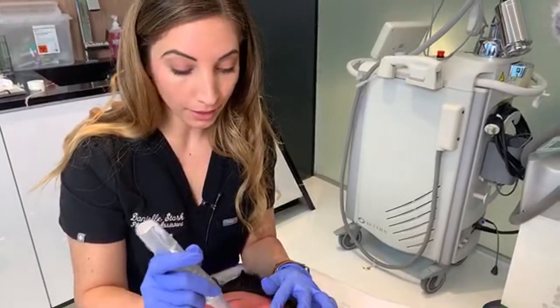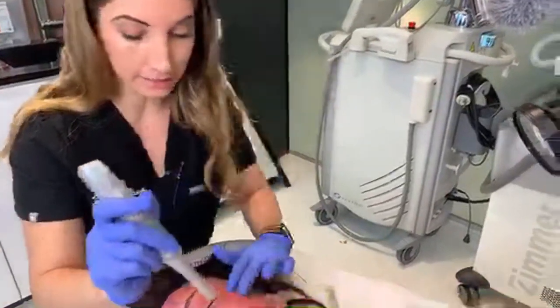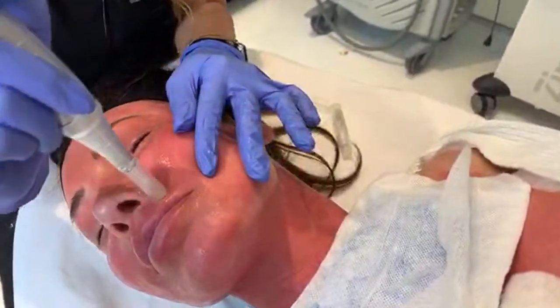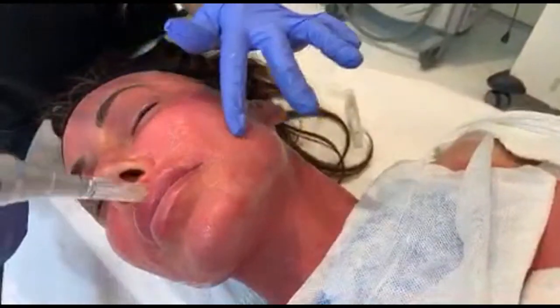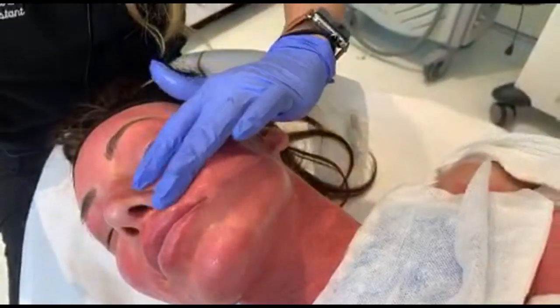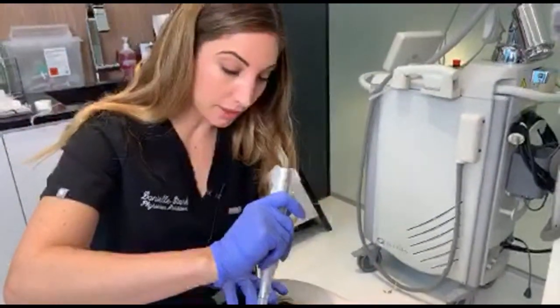0.5. We have smaller micro rollers that are great for around the eyes. And you want to make sure that you're very gentle with your micro roller treatment. You want to make sure that you're not just going deep because you think it'll be better. It's not. When it comes to skin, less is more. You want to be gentle with it.